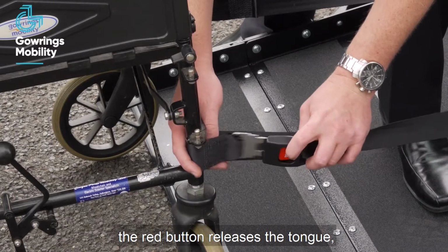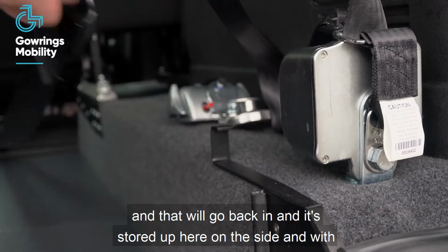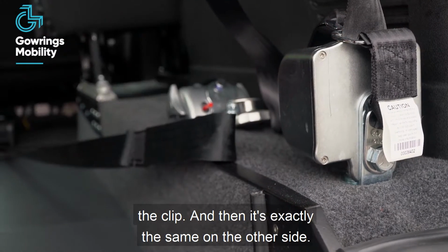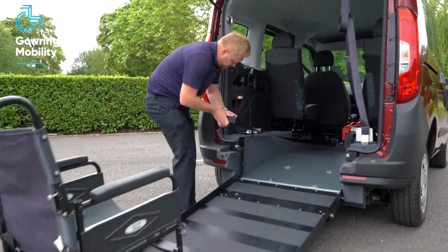The red button will release the tongue, and that will go back in and is stored up here on the side in the clip, and then exactly the same on the other side.